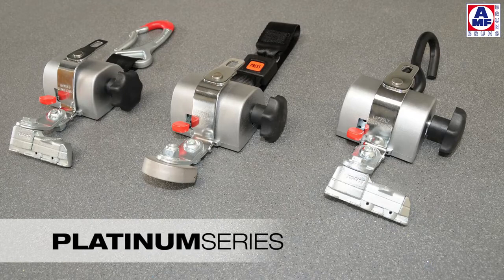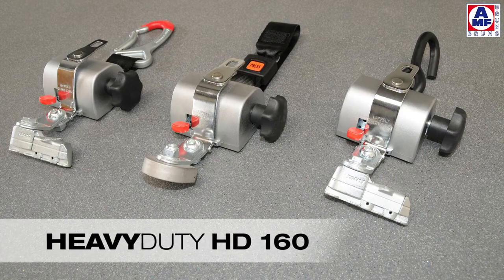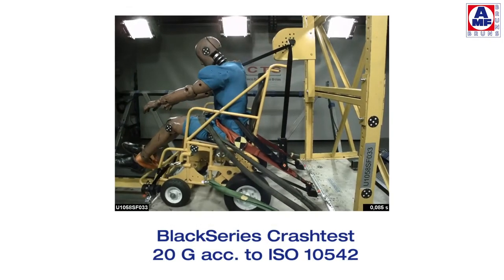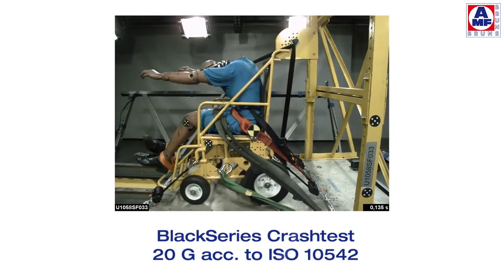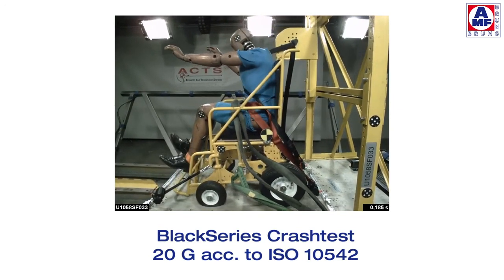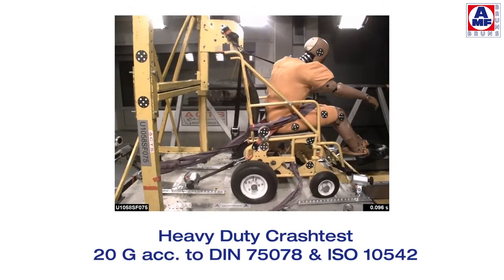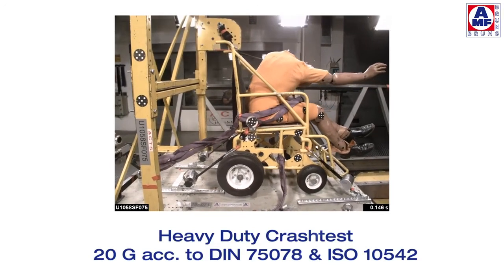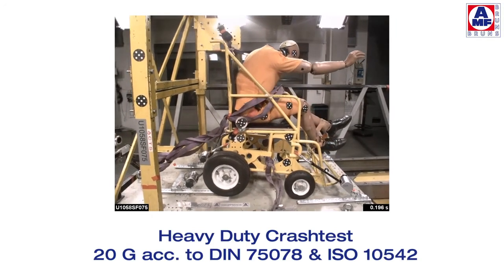For heavy wheelchairs, AMF Bruns recommends the use of so-called heavy-duty retractors for applications up to 160 kilograms. The Protector System has been tested successfully worldwide. In all tests, the results exceed the required safety standards. Even for electric wheelchairs, the Protector System is safer than any other known system. During a run of crash tests and practical driving tests for wheelchairs and their occupants, the Protector System from AMF Bruns passed.